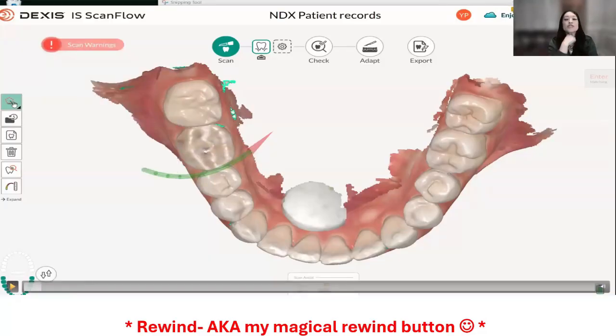So the second tool was a brush tool where we would use it like a brush or an eraser, and we would just brush over. And the third tool was a circle cut and would make a complete circle cut. The video will play and you'll be able to see those functionalities again, the 3 different tools.